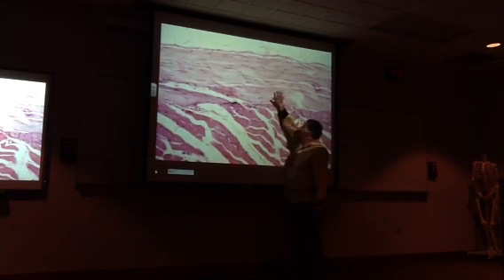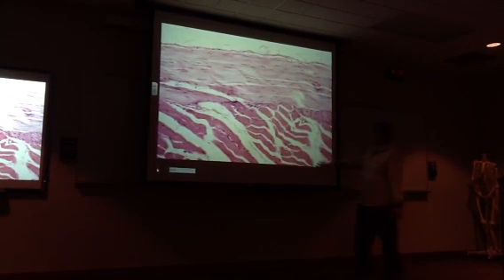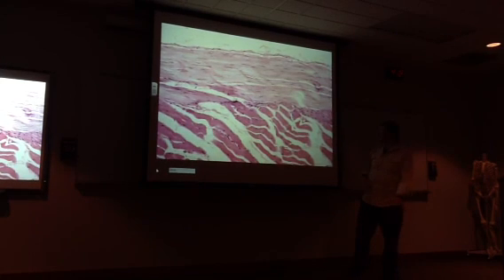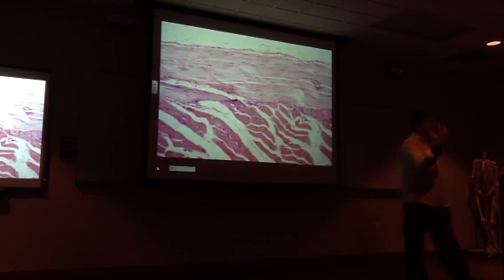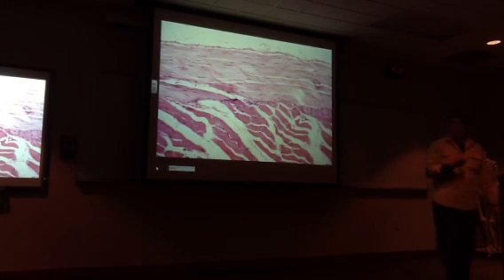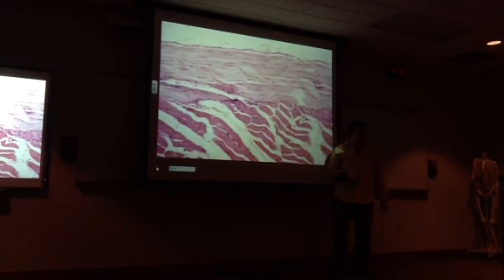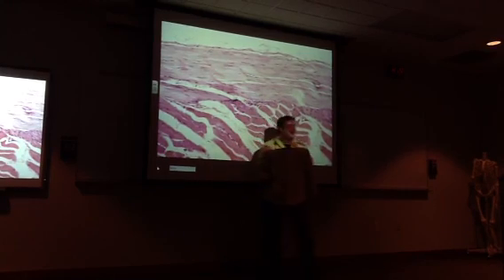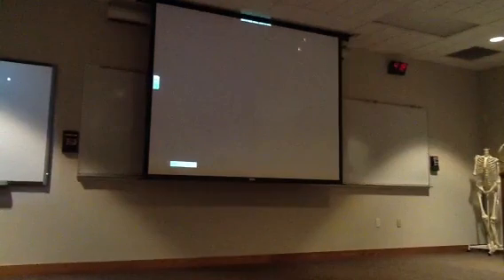Skeletal muscle and a tendon. Okay, now this one is tricky because you don't really see the striations. Now, if you're on a microscope, you could focus and see the striations, but you can see the peripheral nuclei, and muscle stains much more eosinophilic, much redder in color, or more orange in color than the connective tissue of the tendon. And the nuclei that you see in the connective tissue are nuclei of fibrocytes, or fibroblasts. And that's the end of muscle.